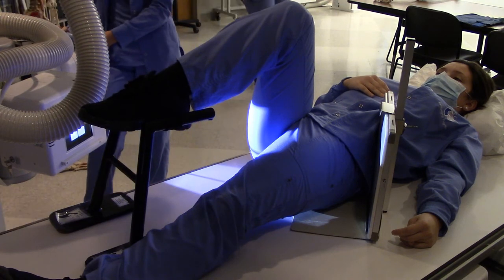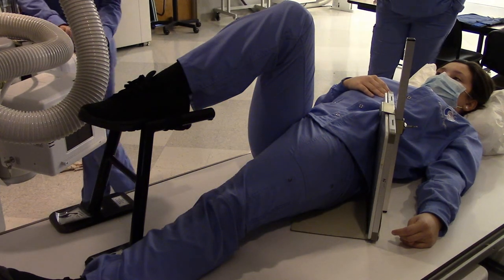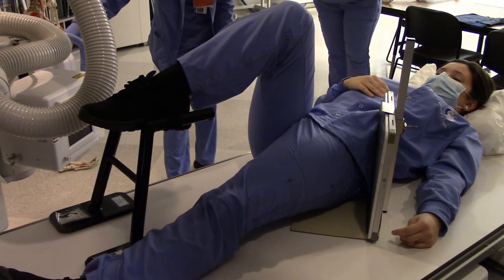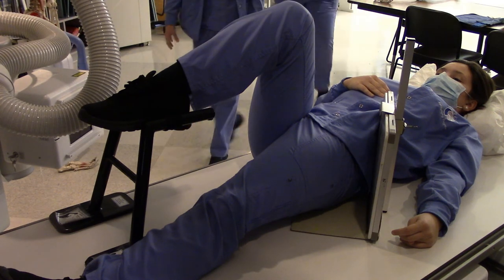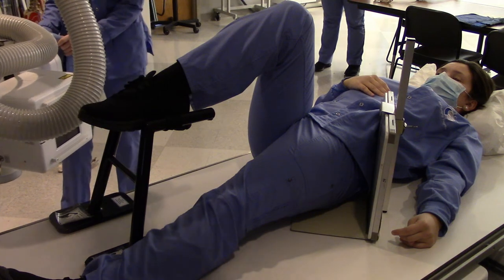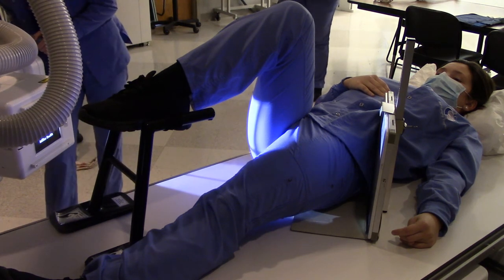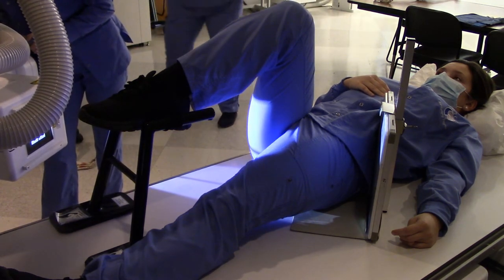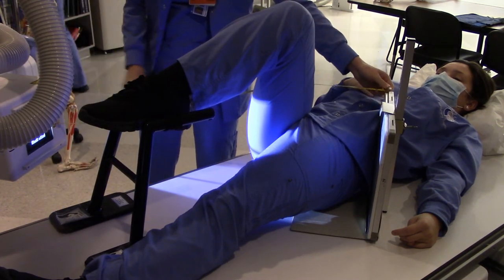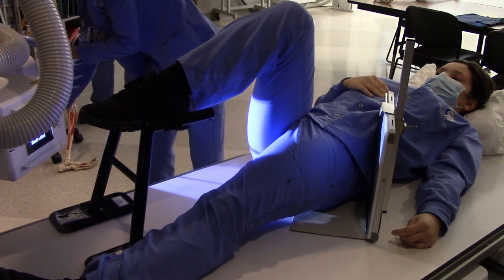The easiest way is to stand right back here — her leg's kind of in the way, I think you need to go back more. Angle back towards that wall over there, and aim for the center of the image receptor. You should be right through the crease between your patient's legs — yeah, right there. The SID is way off, so let's see if we can go a little closer and bump it right up to the table.